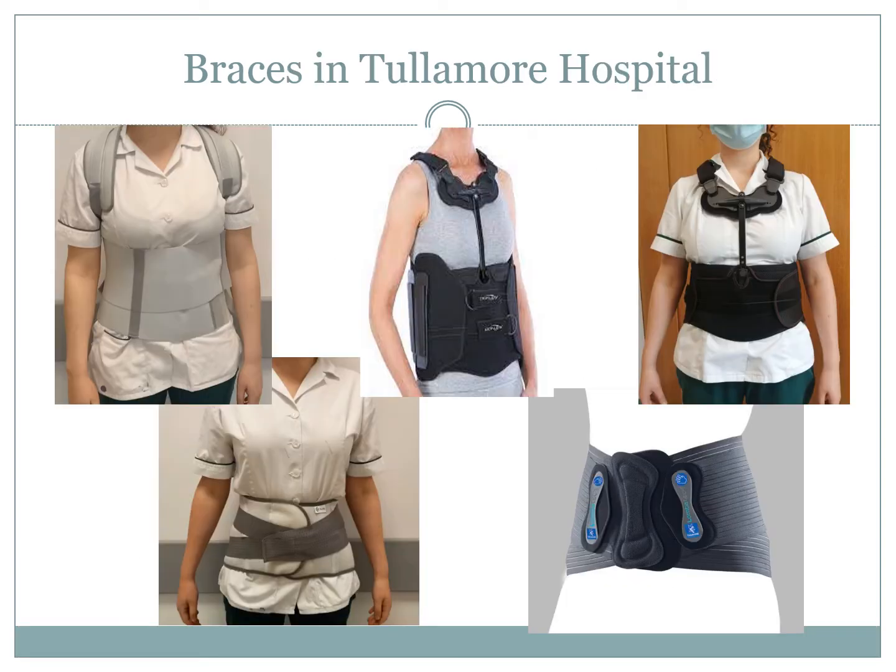There are a number of different types of spinal braces in Tullamore Hospital, which can be seen here in the picture on this slide. The OT will decide on what spinal brace is most appropriate for fitting based on a number of different factors. We will emphasise the name and the wearing regime on their orthotic instruction sheet and the transfer letter if appropriate.